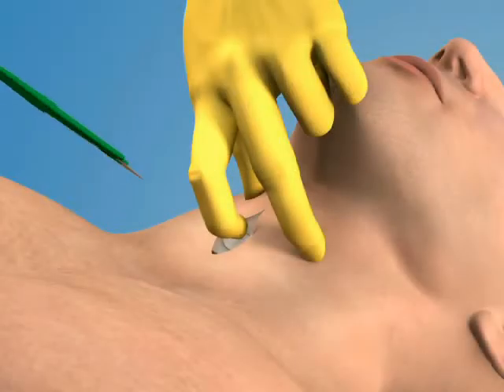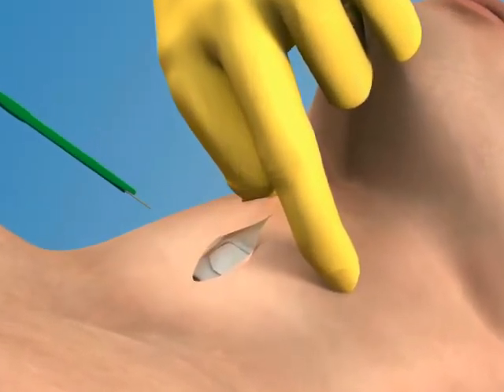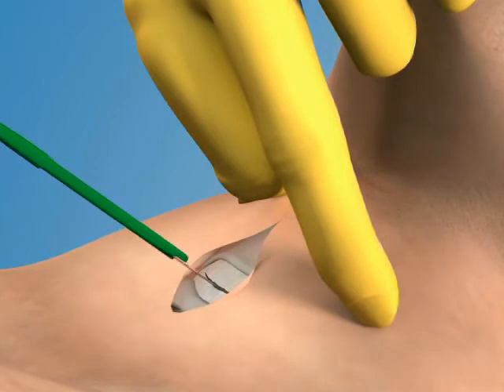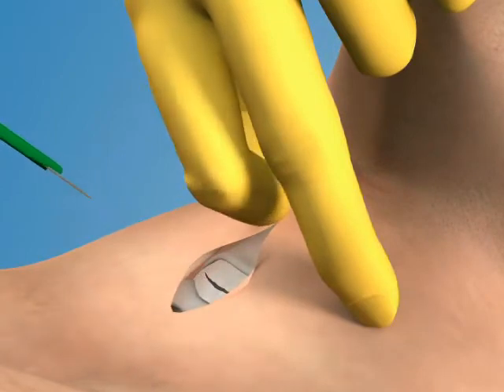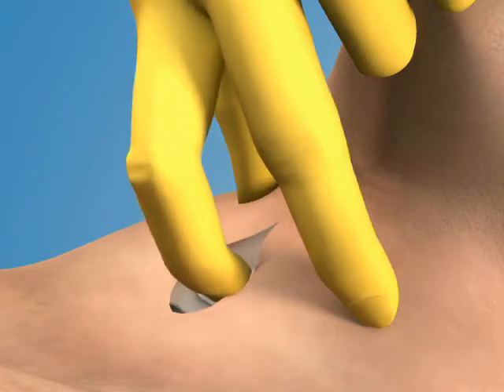Once the membrane has been located, make a stabbing horizontal incision through the lower portion of the cricothyroid membrane. Temporarily place your index finger into the stoma to maintain a firm fix on its location.